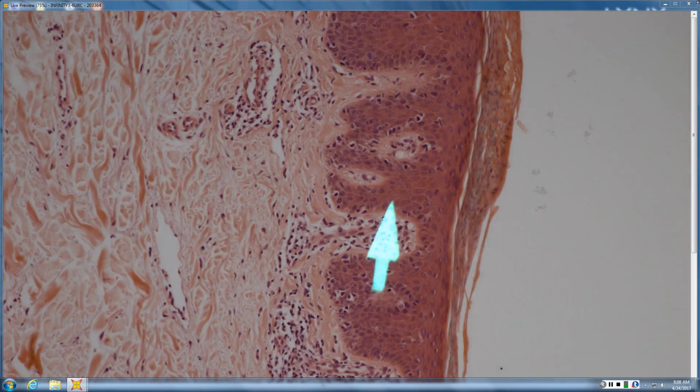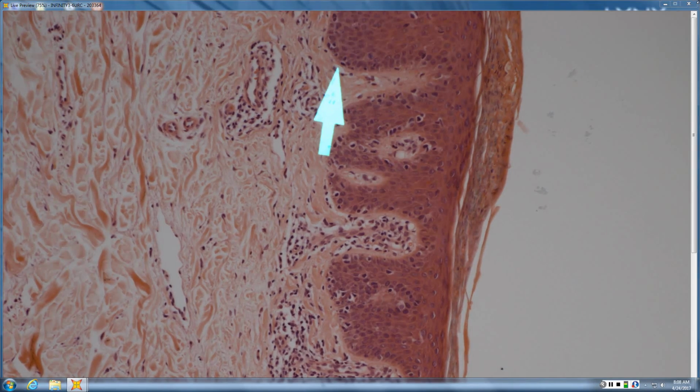Okay, so once again, real quick: compact, usually orthokeratotic, not parakeratotic like this one. Basilar tagging, lymph in every hole. The lymphocytes are large, dark, angulated. Papillodermal fibrosis, bare underbelly to the infiltrate around the vessels.